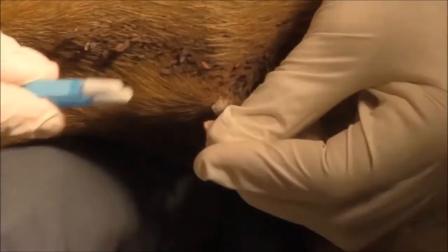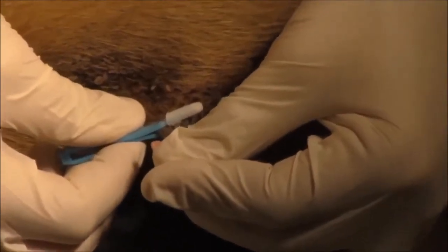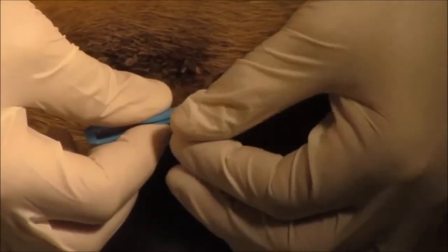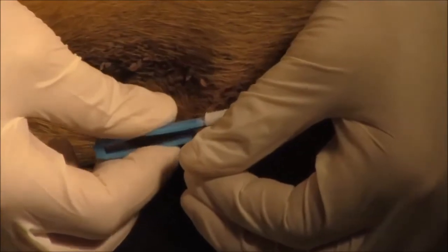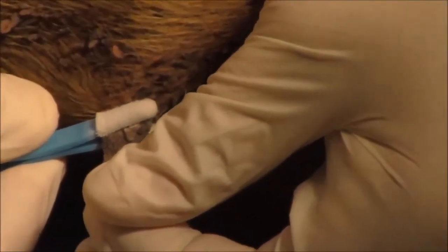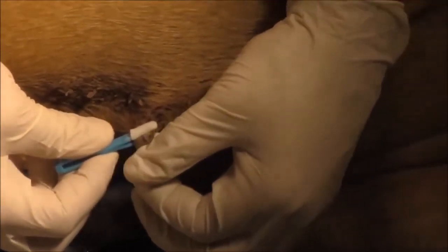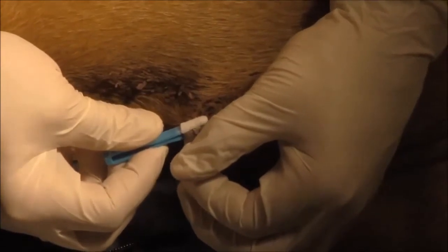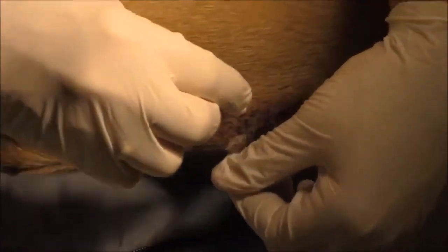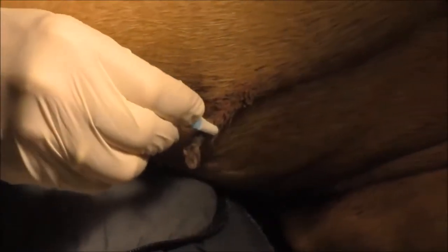I'm going to let it sit for a second longer, then put it back on. Now it's cold — just move it around a little bit. You can see he's got all these little skin tags that we can take off. It will take a little more time, but for this video I wanted to show you on this big one, because this is usually what people come in about. Typically these big dogs get them on their chest from laying too long on one area.